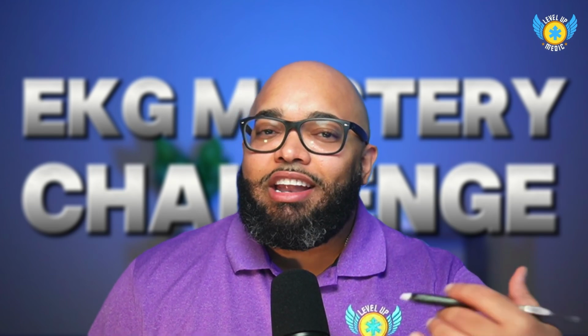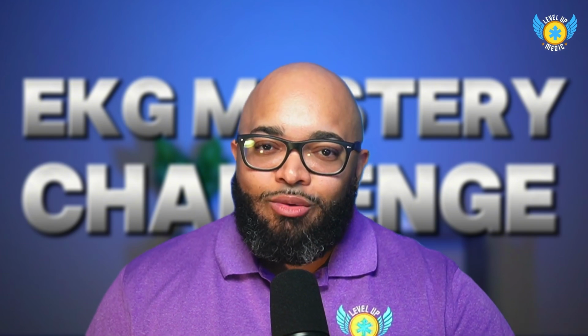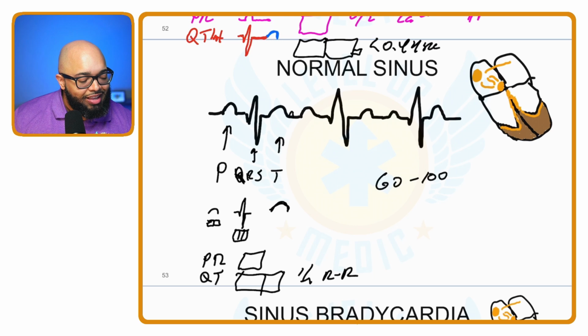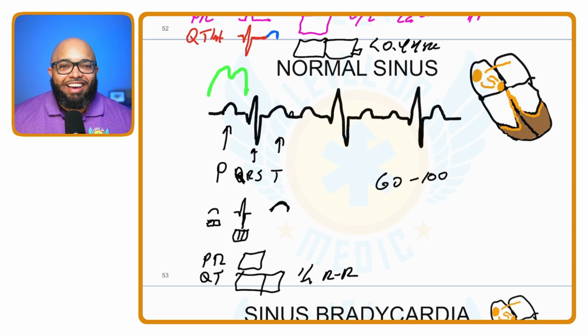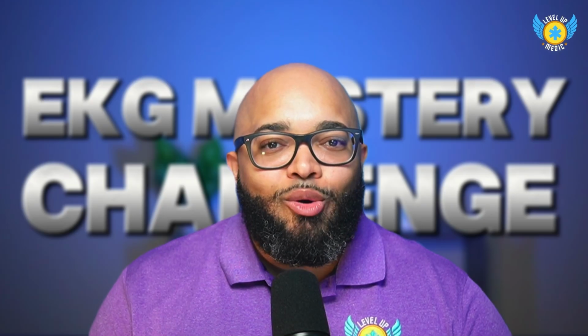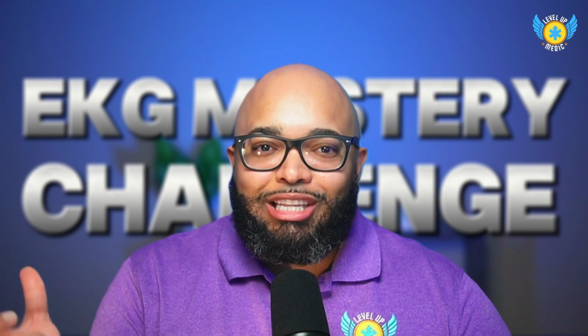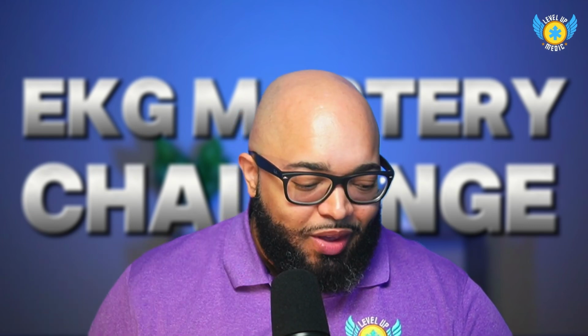But if you're looking at another lead outside of aVR and V1 and the P wave is upside down, that probably tells you there's a problem. It could be, for instance, a junctional rhythm. What if the P wave has 2 humps instead of 1? Remember, the P wave deals with the atria. So if we have a P wave with 2 humps, that's probably going to be atrial enlargement or atrial dilation, okay?